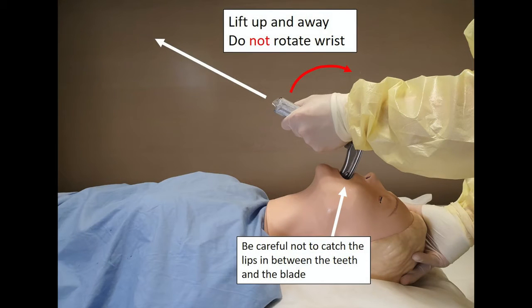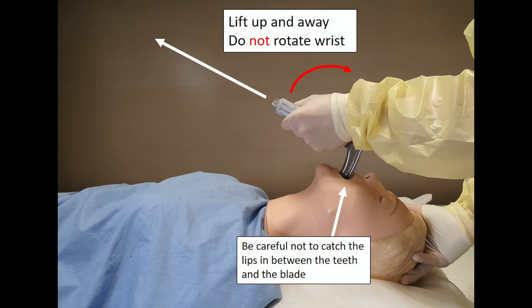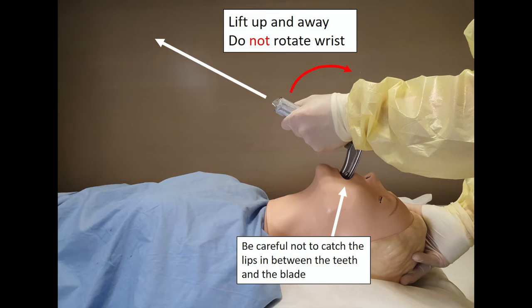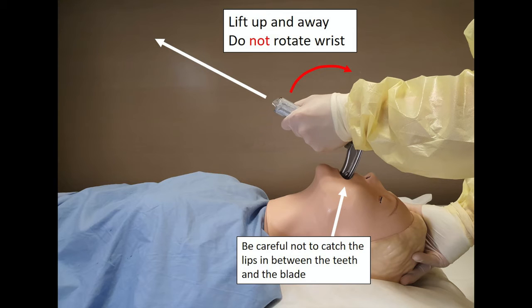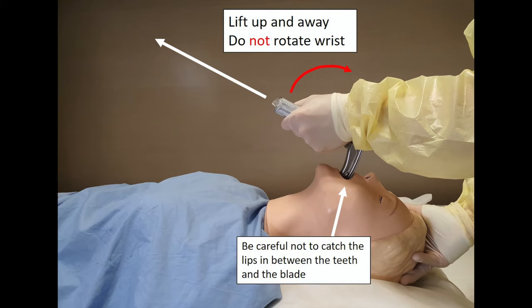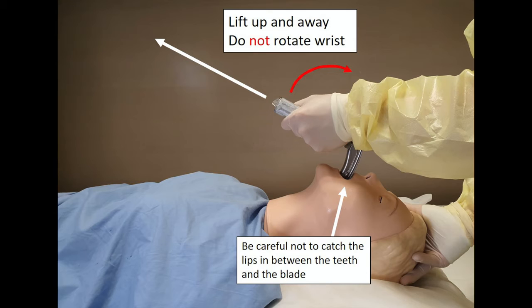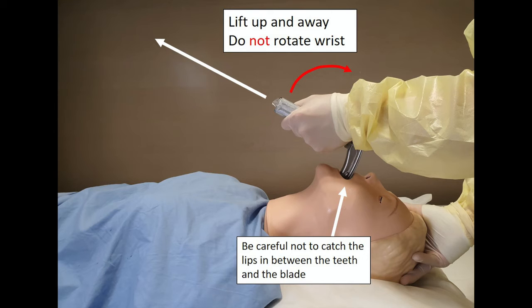Now it is important to describe how to safely maneuver the laryngoscope blade. During intubation, do not rotate the laryngoscope as this will damage the upper teeth and mucosa of the patient. Instead, with the tip of the blade in the vallecula or the base of the epiglottis, lift the laryngoscope up and away from the patient's head as directed by the arrow in this figure. This will help to optimize direct visualization of the vocal cords when using a direct laryngoscope. A common mistake is also to insert the blade too deep, making it impossible to identify the vocal cords or epiglottis. Instead, the appropriate technique is to progressively advance the blade and identify landmarks along the way such as the uvula, the epiglottis, and the vocal cords.